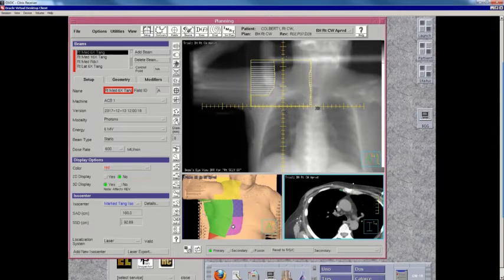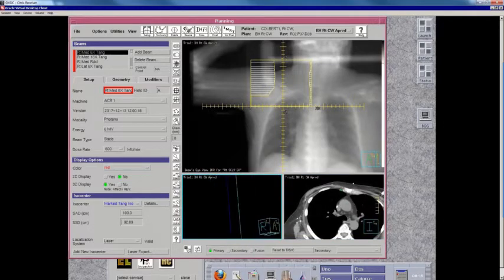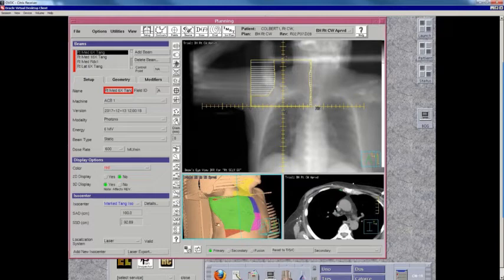When we simmed her, I marked, or probably Lauren marked because I wasn't doing any work, the scar and the borders. So I typically just mark medial. I look at the other breast and the contralateral inframammary sulcus, and in my mind place it on this side, and then I like to put at least about a 2 centimeter margin from where the breast was sitting down to my inferior field edge, which I've marked with radio opaque wire here. And then I often will put a posterolateral marker. I can't quite tell if I marked her drain sites or not, but it would be very common for me to mark the drain sites in a patient with T4 disease.